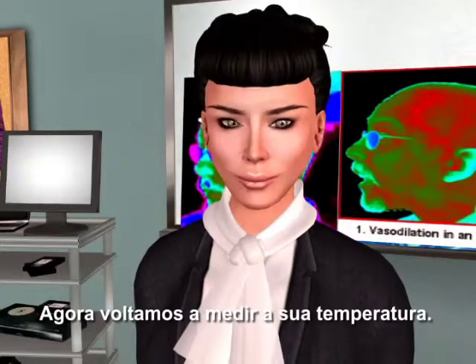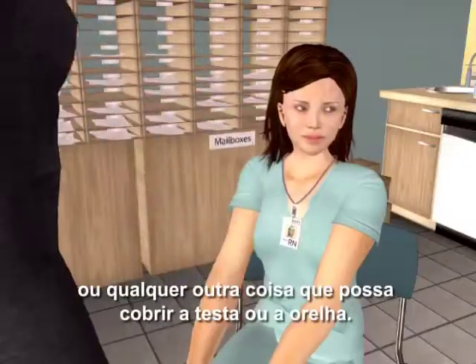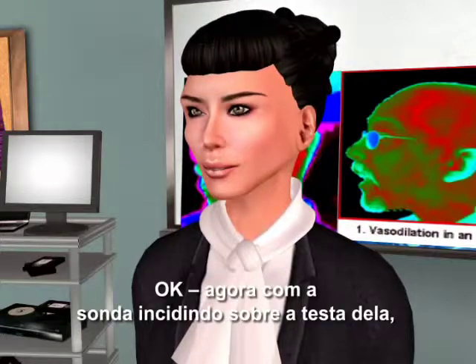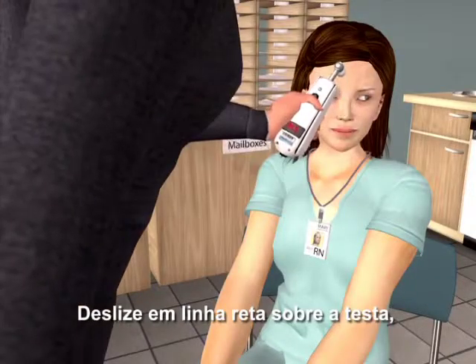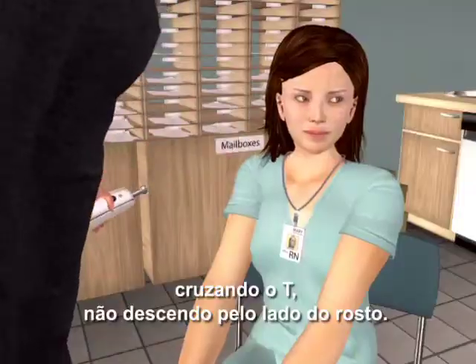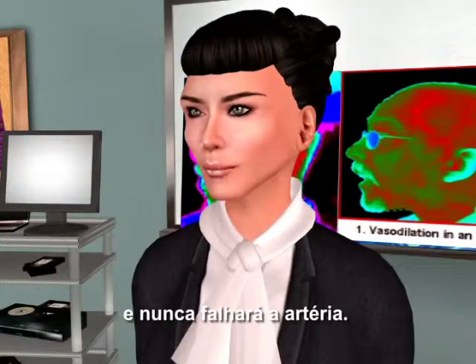Now back to taking your temperature. After wiping the probe head, brush away any hair or anything else that might be covering the forehead or the ear. Now with the probe flush on her forehead, depress the button and keep it depressed until you are done. Slide straight across the forehead, crossing the T's, not down the side of the face. Scan in a straight line to cross the T's and you'll never miss the artery.